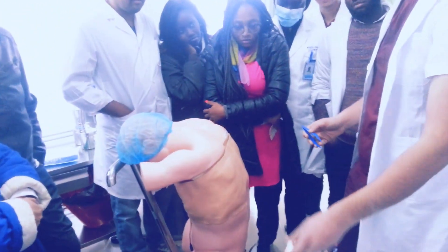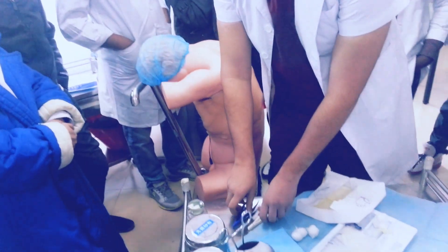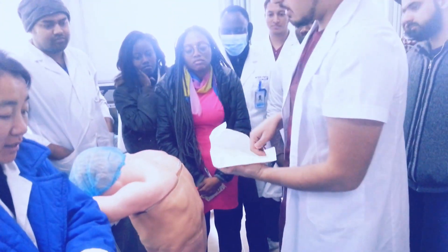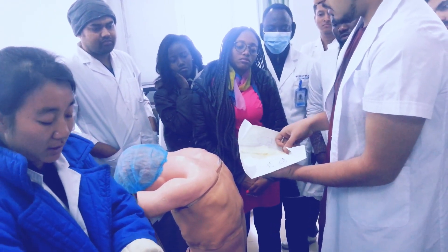You have to throw this here, but it is not used so I put it back. Then I will take the glove in my hand — you can even go from there, but it is not used.